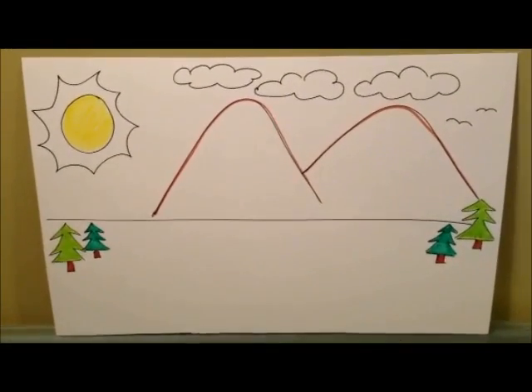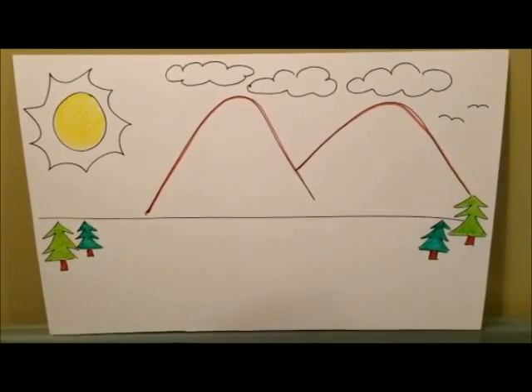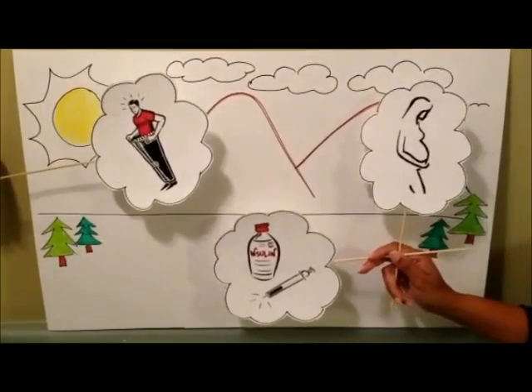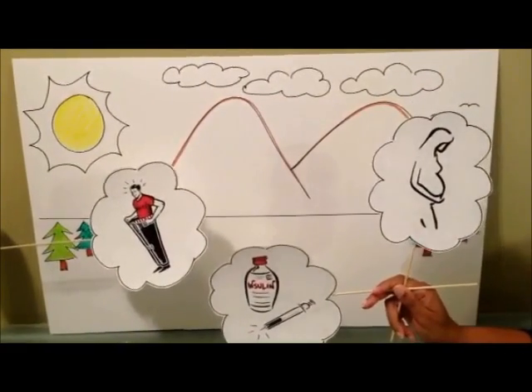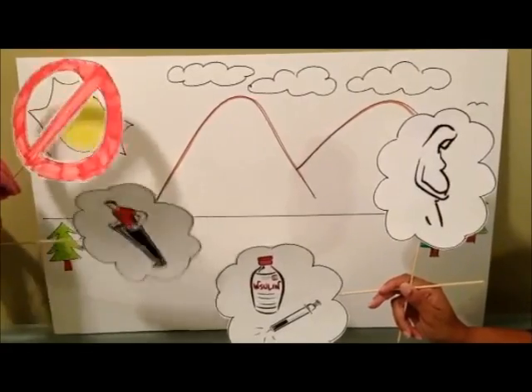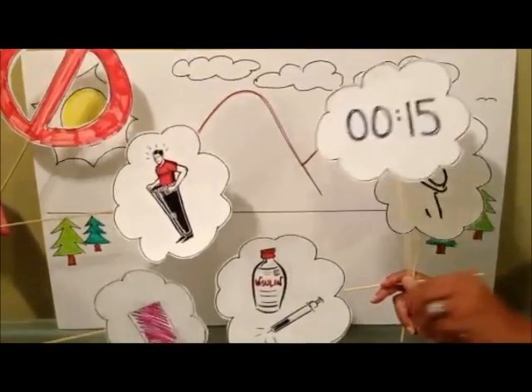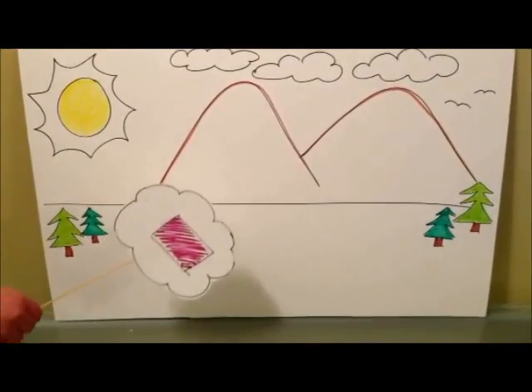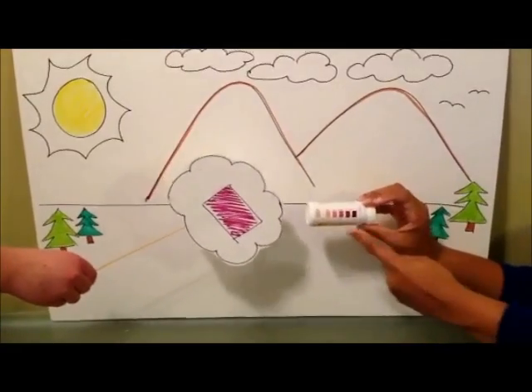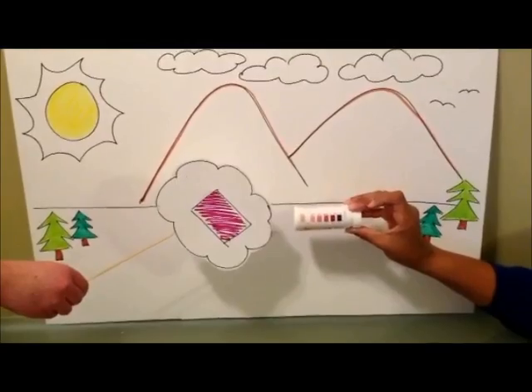Now let's review a little bit about what we just talked about. Ketostix are used by diabetic, pregnant, and dieting patients to measure the amount of ketones in the urine. Remember to check the expiration date before use and store your Ketostix in a cool, dry place. Also, it is important to check the color of the Ketostix exactly 15 seconds after contact with urine. Then compare the Ketostix to the color chart provided on the bottle. If the color has changed to a dark or deep purple, please contact your healthcare provider immediately.